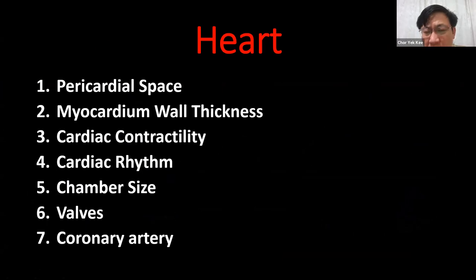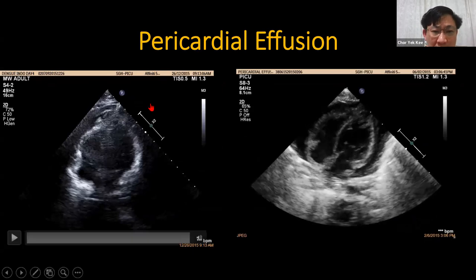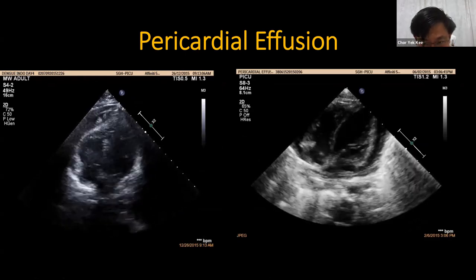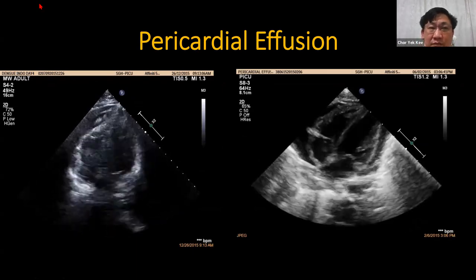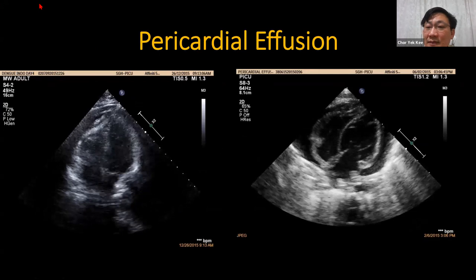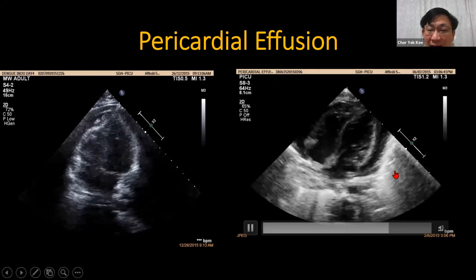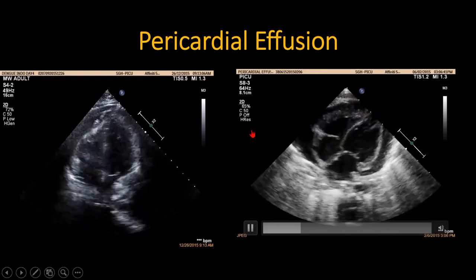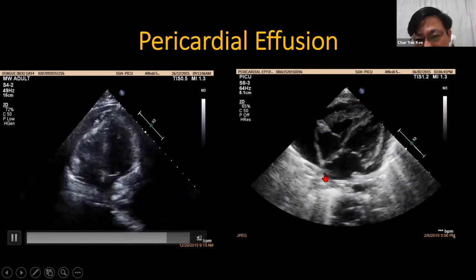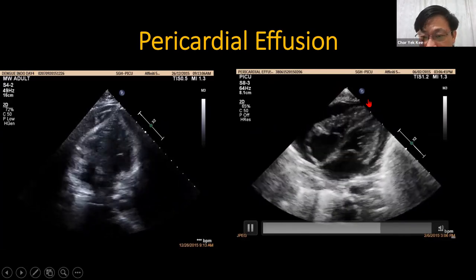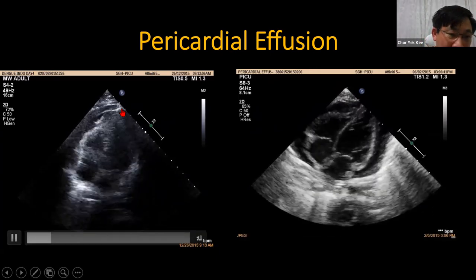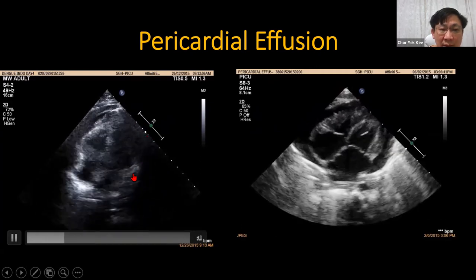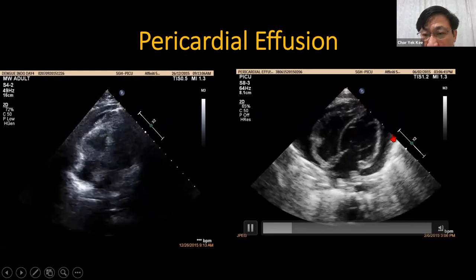After knowing the basic views of echo, let's go through some common clinical scenarios. This first clip — anyone want to guess what the image shows? The answer is pericardial effusion. You can see a clear pericardial effusion with some fibrin inside — this is a pericardial empyema, meaning there is pus around the heart.